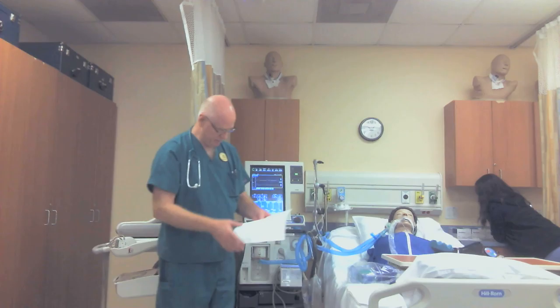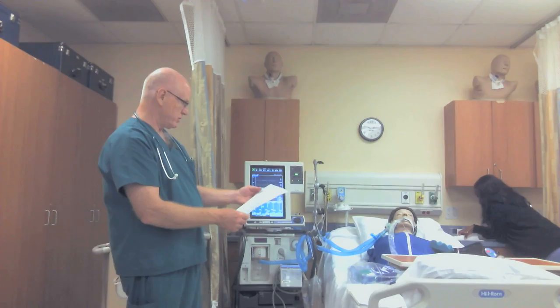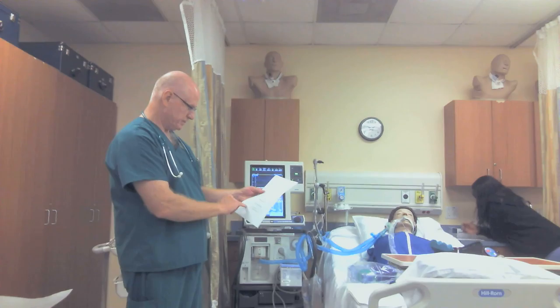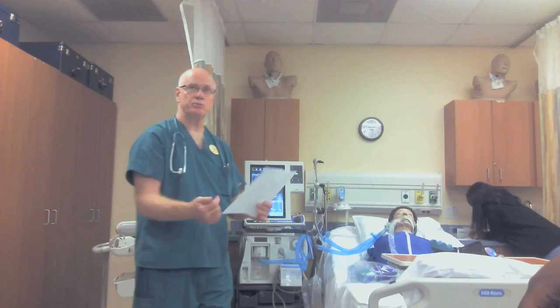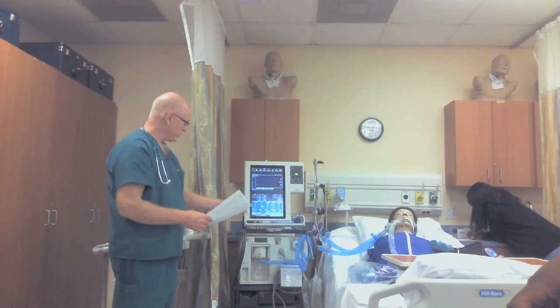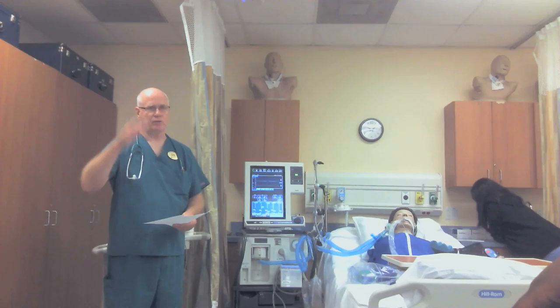Alright — record ventilator settings. Number 14: perform inspiratory pause and record the plateau pressure. There's a place on the back of the flow sheet to record your plateau pressure under P-plat. Number 15: record ventilator settings. Number 16: perform the expiratory pause, record your total PEEP. Number 17: verify alarm settings — check your alarm settings to make sure they're correct. The instructors will probably move a couple of them. You have to look and see if they're set correctly; if they are, leave them alone.